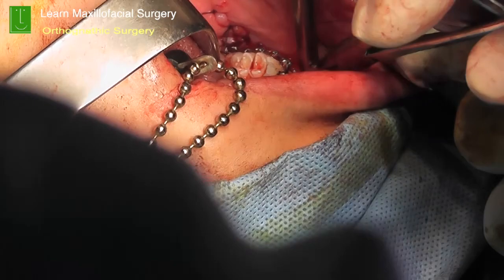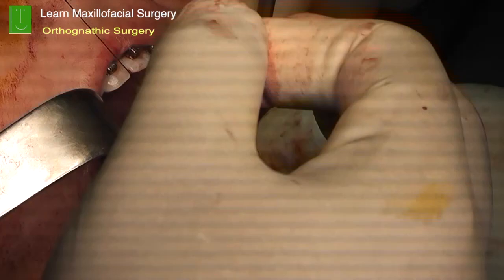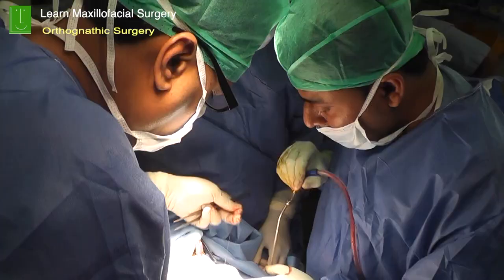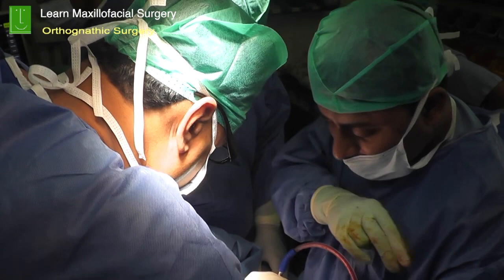So it is very, very important that all these small tubes are always secured so they don't get dislodged and the patient does not aspirate it. So it's very important you take a bite through the tube itself, and that suction drainage tube can be removed in about 24 hours following the surgery, 24 or 48 hours depending on the amount of bleeding and hematoma which accumulates over there. Most of the times this is a routine procedure.